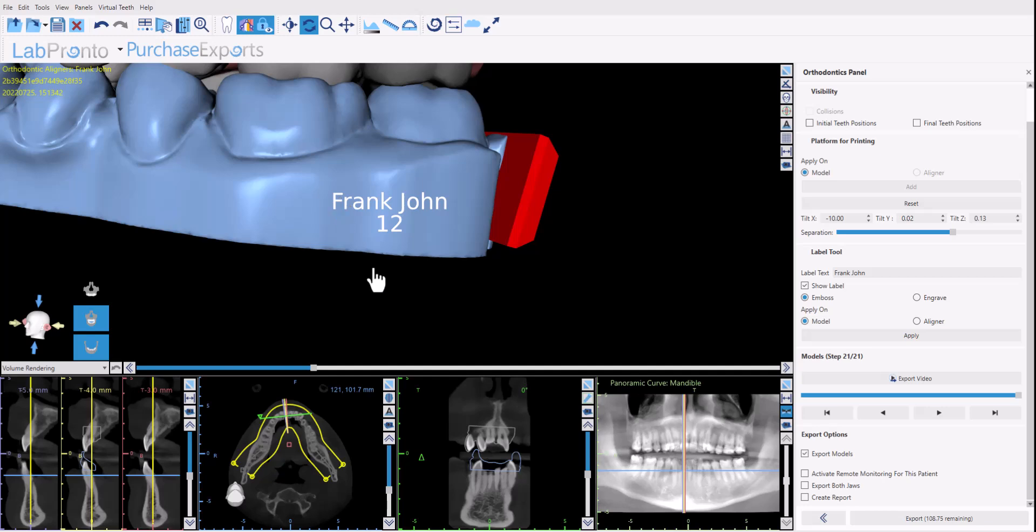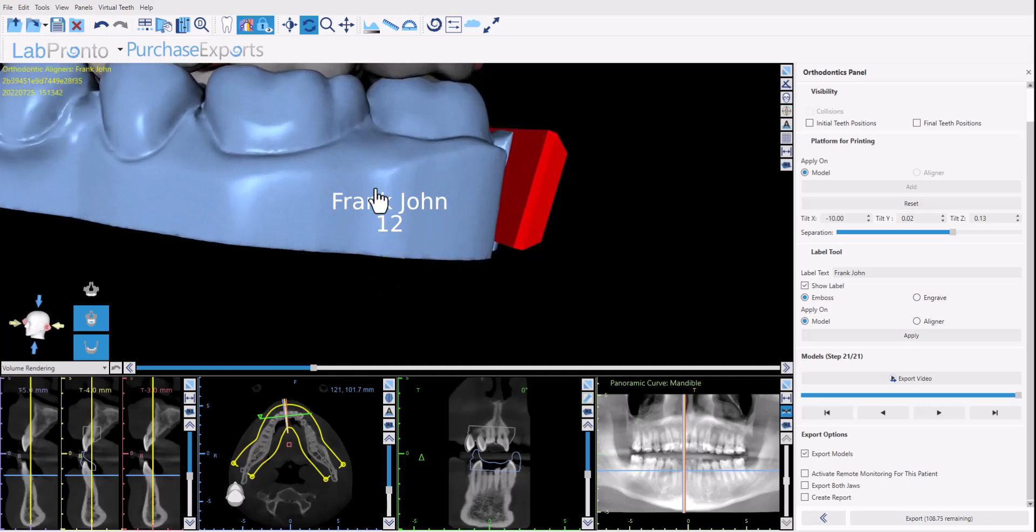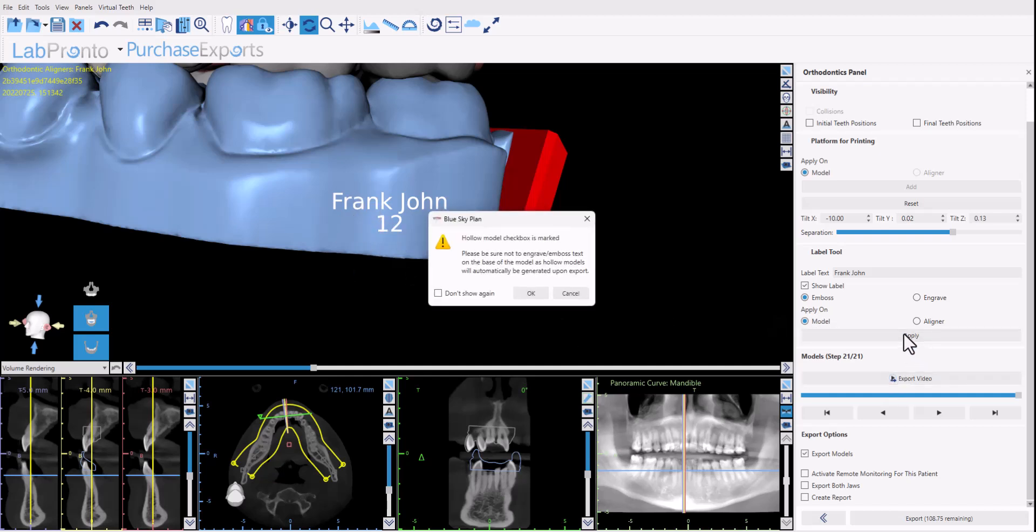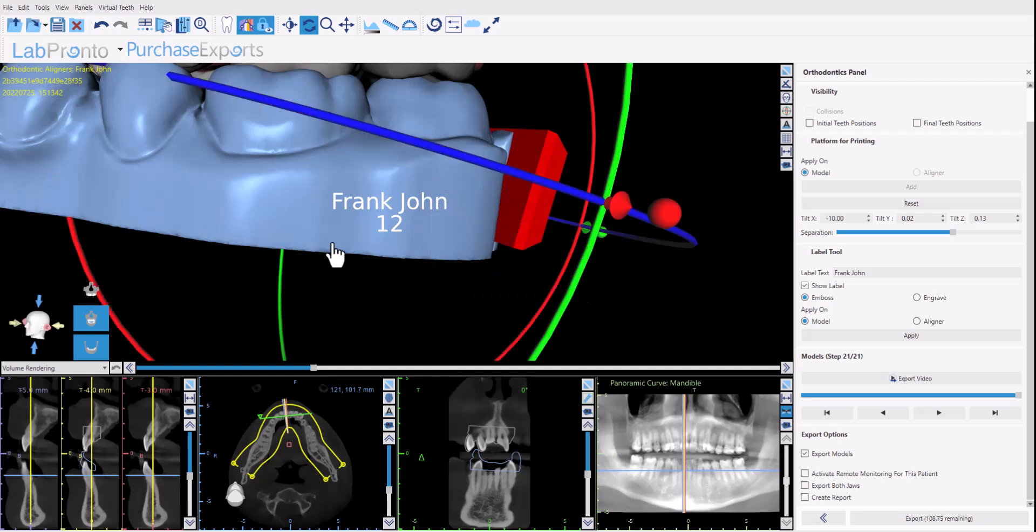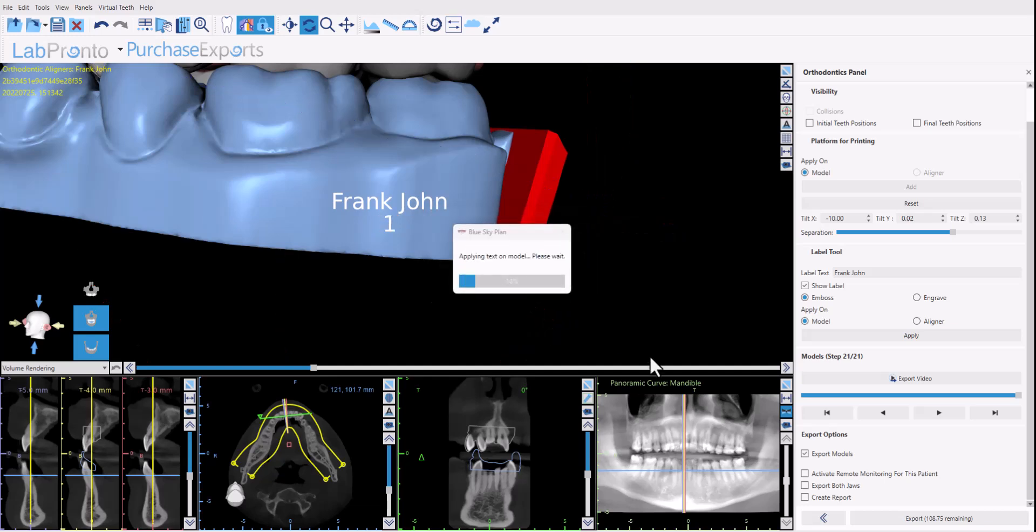So once you have the text sized and positioned you could apply it on the model or on the liner if you've designed the liners and you're exporting the liner. So once you have everything set up and positioned simply click apply. Here it says the hollow model checkbox is marked which is what we discussed previously and it's just pointing out not to emboss or engrave too close to the edge. Click apply okay and now it goes model by model and it applies the relevant text and numbering to the relevant model.